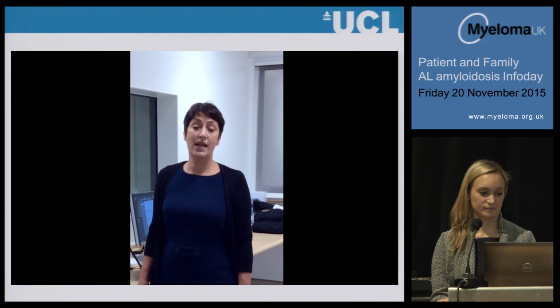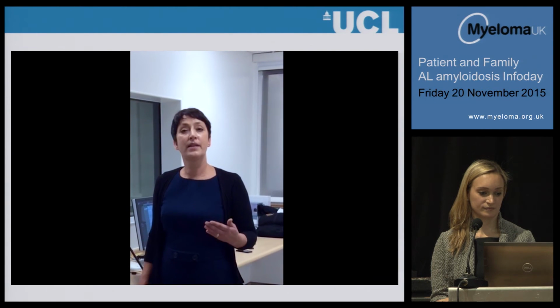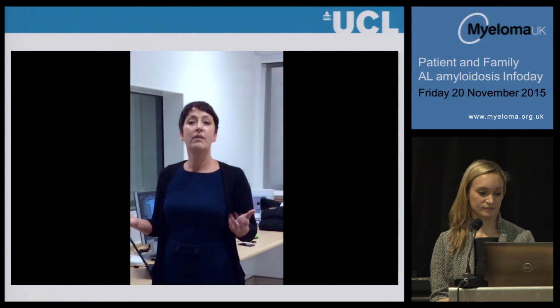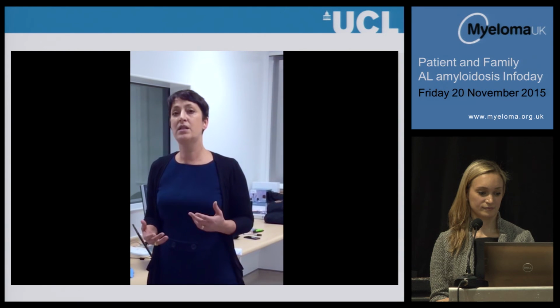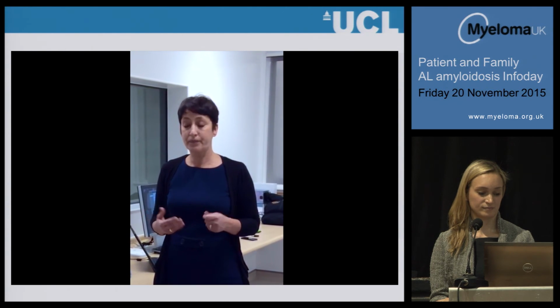Okay, so during your scan, I'll be asking you to hold your breath. The instructions are breathe in, breathe out and stop. And you hold your breath normally for about 5 or 6 seconds while I take the picture. Then I'll ask you to breathe normally. The scan on average takes about 45 minutes. However, if you're finding it difficult, then I can modify the scan and make it quicker.